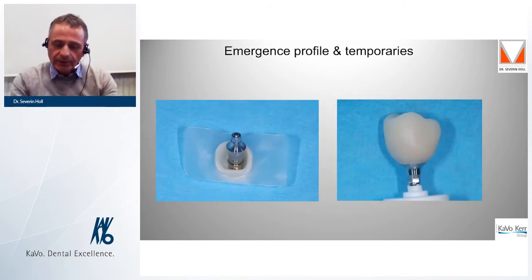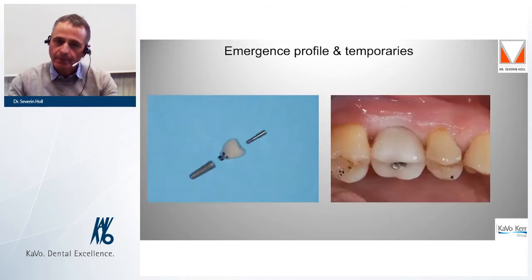Thereby, the abutment is fixed in the provisional crown and can simply be shaped with acryl outside of the mouth to a high-quality temporary crown, as you can see on the right side. What did we achieve? We obtain a screwed temporary restoration without using any resin or cement in our surgery site. For me, this is the best solution to shape the gingiva in the healing period. Our temporaries are taken out of occlusion.